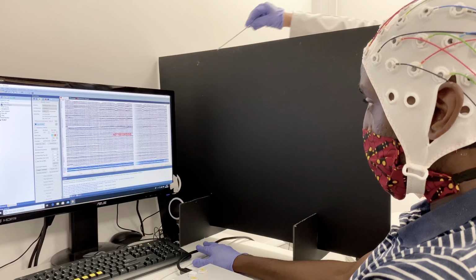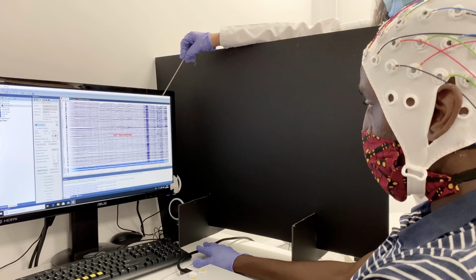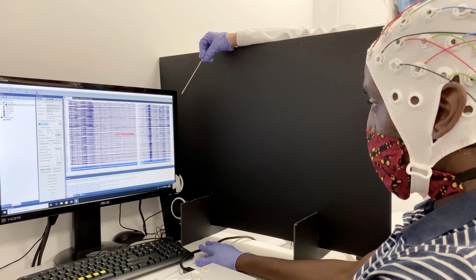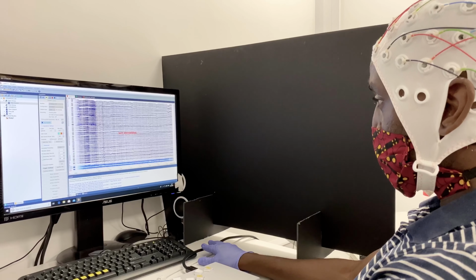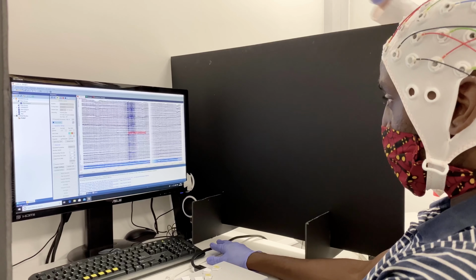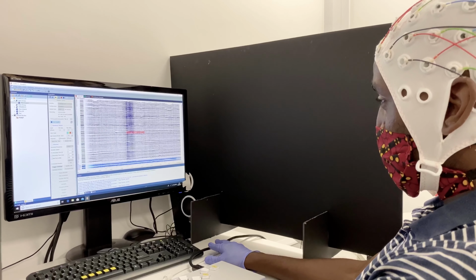Can you please chew for me? Oh, here we go. Do you see that? When you are chewing, you are moving the whole cap because of the muscles. So please do not chew through the experiments. Can you please swallow for me? There again. You're human. You are allowed to swallow, but please do not do it that often.